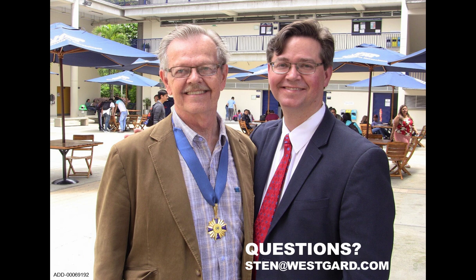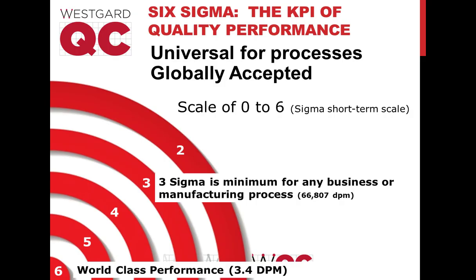What is DPM? Okay, that's a great question, Christy, and let me just pull up the slide that's most relevant. When we talk about Six Sigma, there's 1, 2, 3, 4, 5, 6 sigma, but underneath each category of sigma is a number of defects per million. So Six Sigma works on a scale of 1 million opportunities.